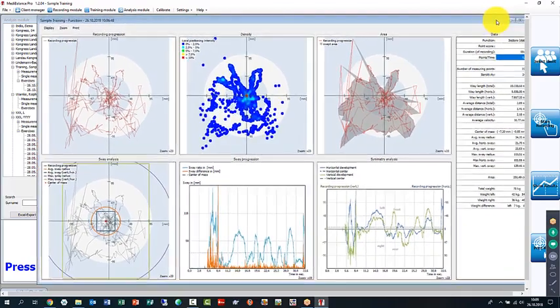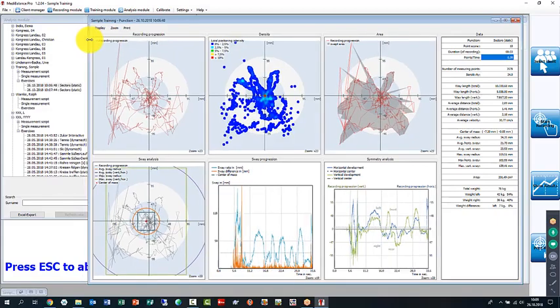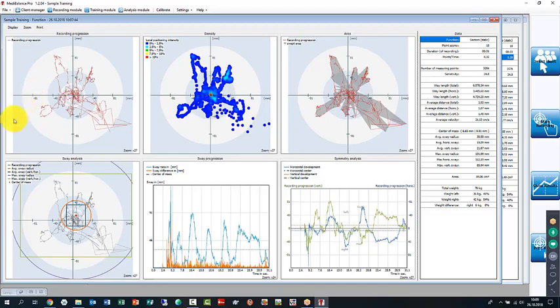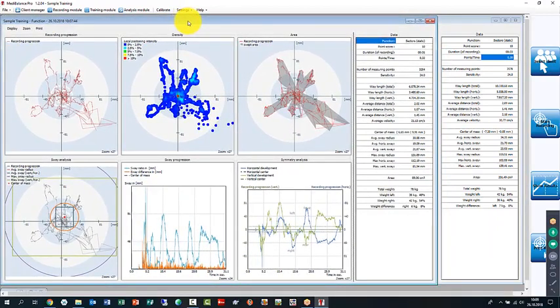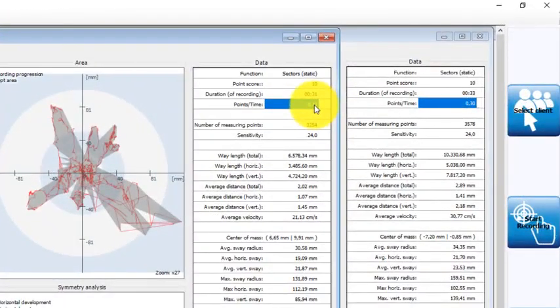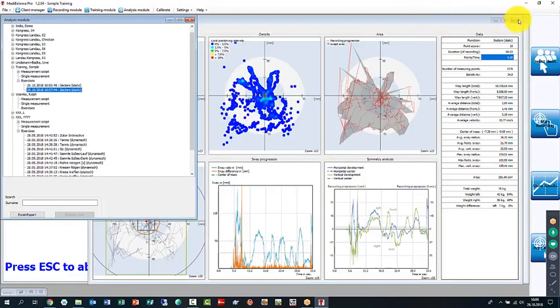So let's see if I can show them both at the same time. Give me a second. Double tap on this. And now I can put them both next to each other and show that, oh look, on the first measurement you did a 0.3 and now you did a 0.32, which is already much better. And what I want to accomplish is that this goes up in due course for the client.